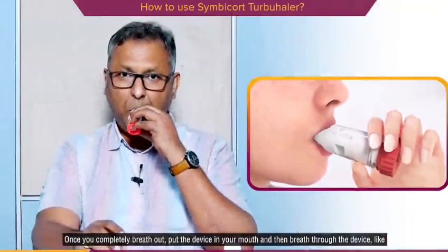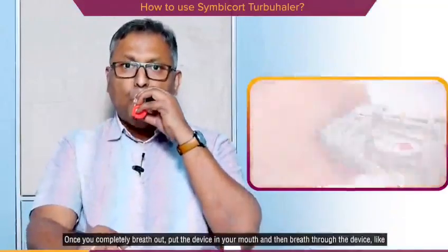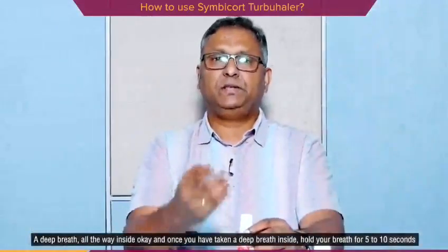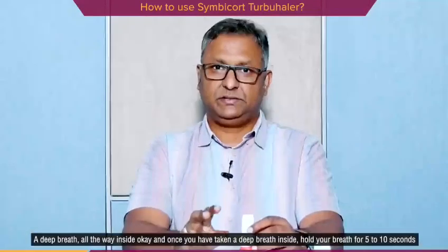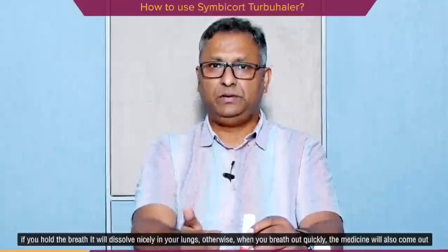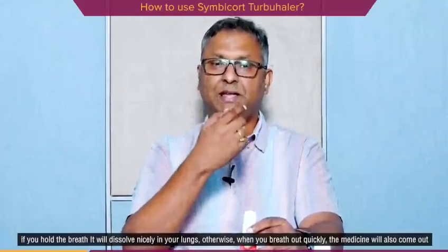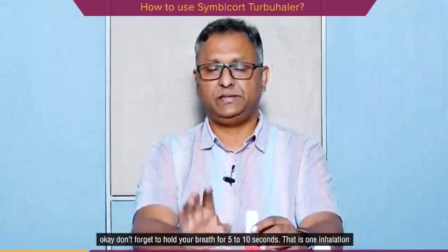Once you completely breathe out, put the device in your mouth and then breathe through the device, a deep breath all the way inside. Okay? And once you've taken a deep breath inside, hold your breath for 5 to 10 seconds. The reason why you hold your breath is, once the medicine has been taken inside your lungs, if you hold the breath, it will dissolve nicely in your lungs. Otherwise, if you breathe out quickly, the medicine also will come out. Okay, don't forget to hold your breath for 5 to 10 seconds.